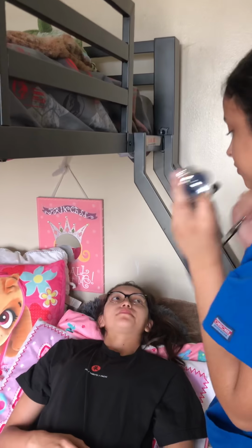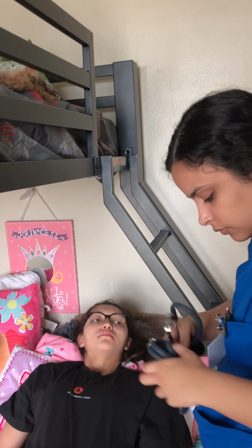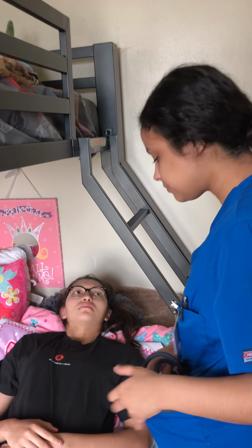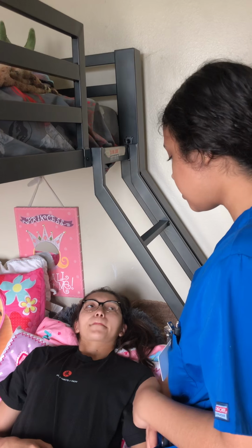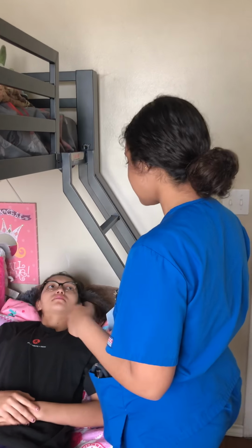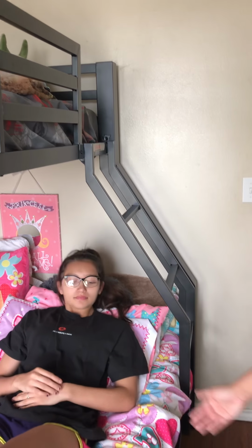Okay, everything sounds good. And after listening to that, that's going to be it for the cardiovascular system. So now I'm going to start the peripheral vascular system, sorry. Okay, for that, you can go ahead and sit to the side of the bed for me, please.